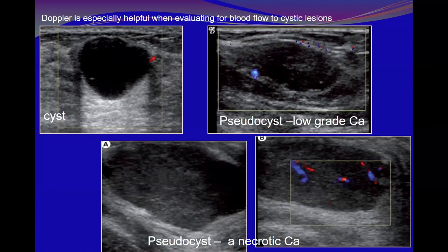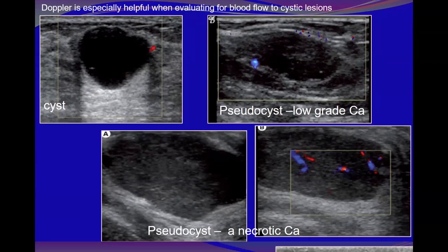Margin always is the key. Margin is the key, okay? So here, this cyst has circumscribed margins, posterior enhancement. I will pass it as just a cyst, a mildly inflamed or modified cyst. But this one, I'll not pass it as a complicated cyst, because of the margins. So we have to proceed for biopsy in such a case.